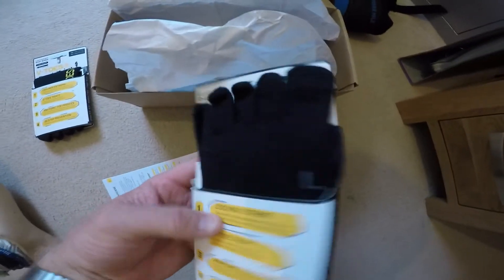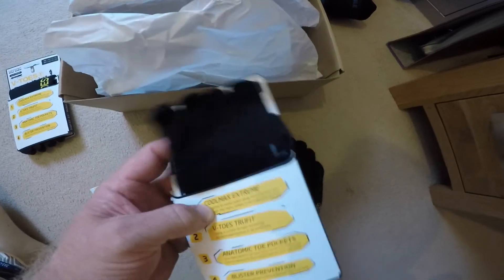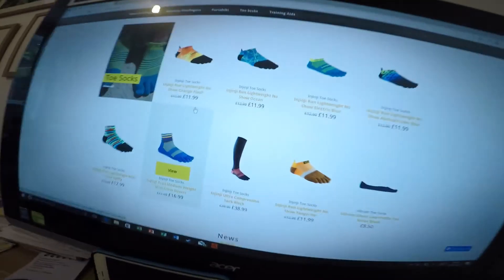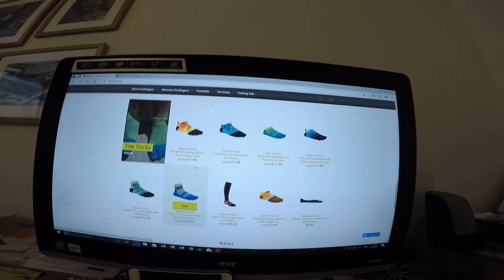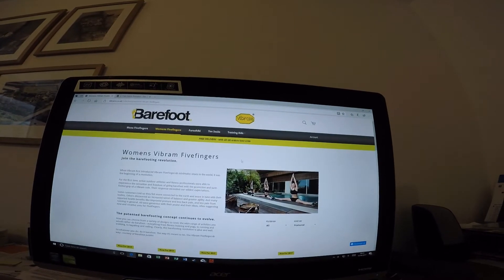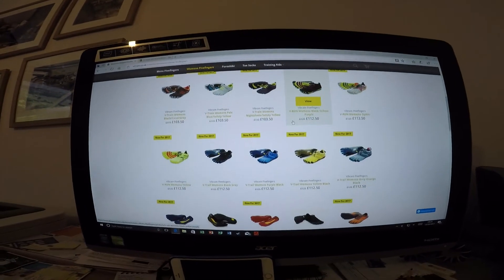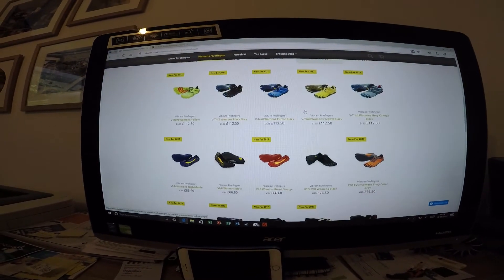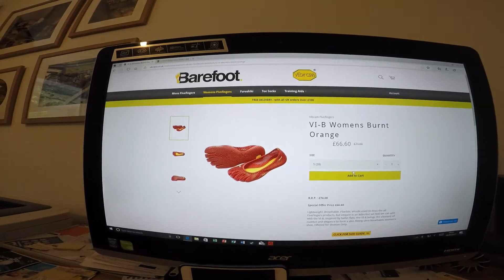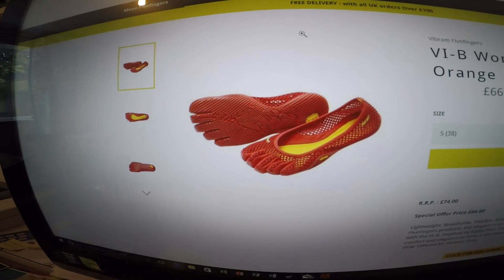At some point I'll get on Facebook and give out the left to somebody on the amputee website - there'll be somebody out there who could do with just the left sock. But there's lots of different colours and styles. When you look at the ladies' ones, there's lots of different styles in there, depending on how outrageous you want to be, or if you're wanting them to be more like a beach shoe.